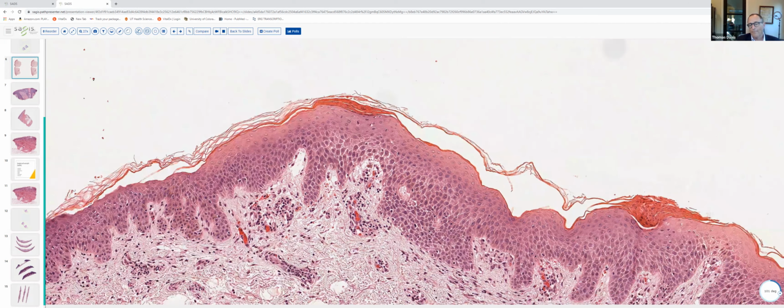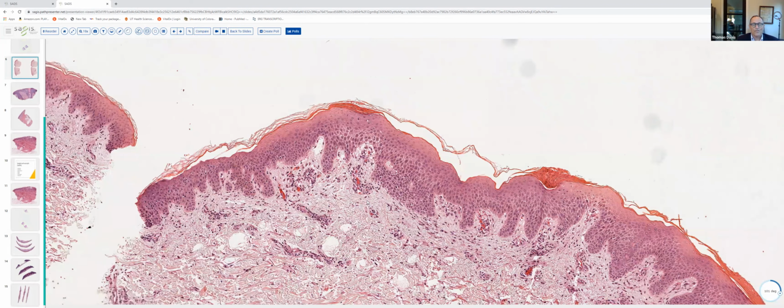This was a biopsy of pityriasis rosea, but in the absence of good clinical data, the differential would indeed be broader. Similar, identical changes may be seen in lesions of erythema annulare centrifugum, and also in subtle expressions of other commonly encountered eczematous dermatitides, such as allergic contact dermatitis, nummular dermatitis, or spongiotic drug eruptions.